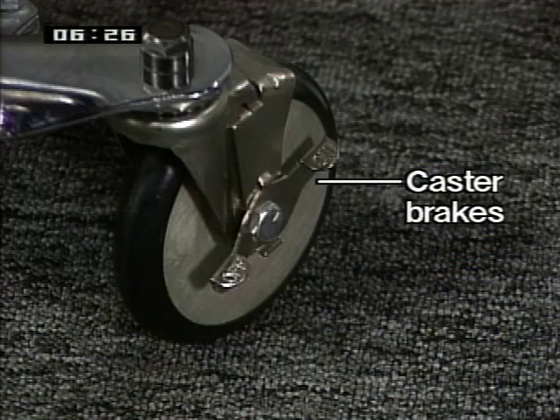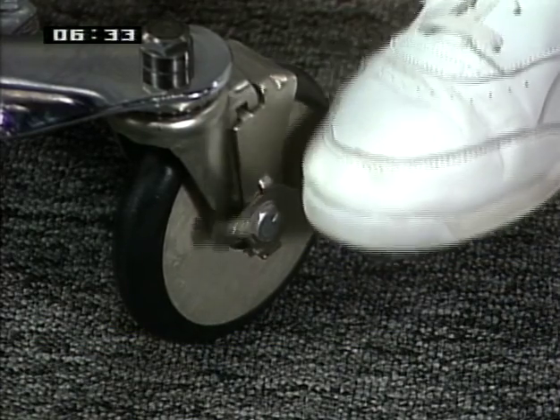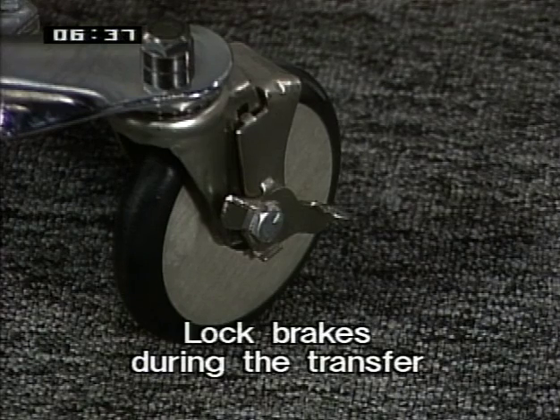2 of the wheels have caster brakes for safety. To lock the casters, step on the cam lever on the side of the caster. To unlock, step on the highest cam lever. You should lock the brakes when transferring the patient.